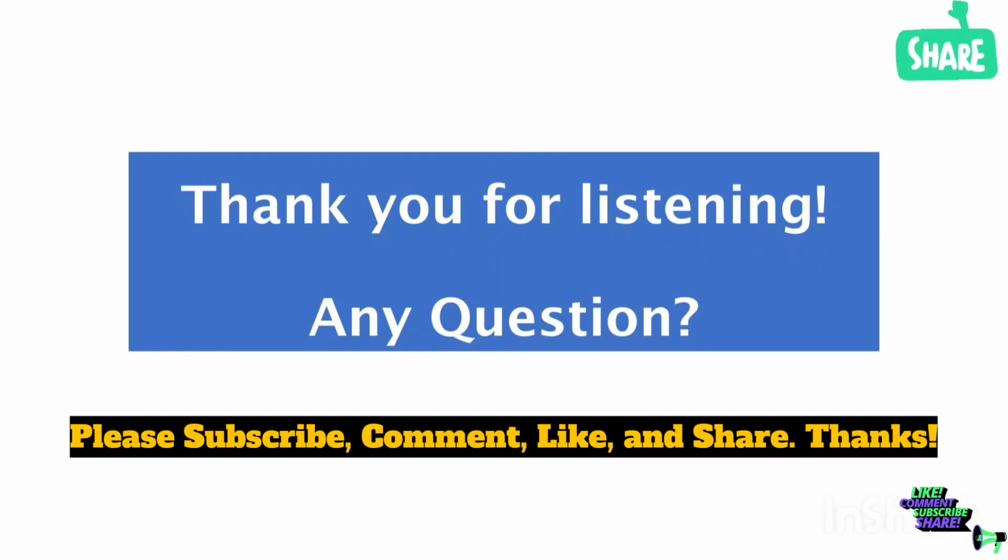I know that this video has taken time, but I would really tell you to take your time to listen to it and make sure you understood it correctly. That will really help you in the interpretation of the Levey-Jennings chart. And of course, when you are presented with any Levey-Jennings chart to interpret during your interview, you won't just say it passed or failed. You can tell them the rules that it has violated, as the case may be. So you can mention 1 2S, 2 2S, even if you may not be able to remember something like the R 4S rule or the 1 3S rule correctly, but if you can learn it like I've shown you, that will be fine.